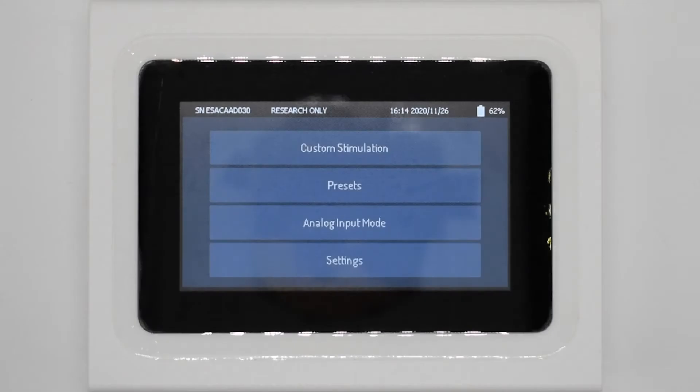Using some camera trickery, we're going to take a closer look at the software on the device itself. Upon turning the NeuroStim on, the first screen presents four options: custom stimulation, where a user decides which stimulation to deliver; presets, where a predefined stimulation can be loaded and delivered; analog input, where the stimulator is connected to the interface module and ready to receive and deliver arbitrary waveforms; and settings, where stimulation logs can be toggled and date and time saved.